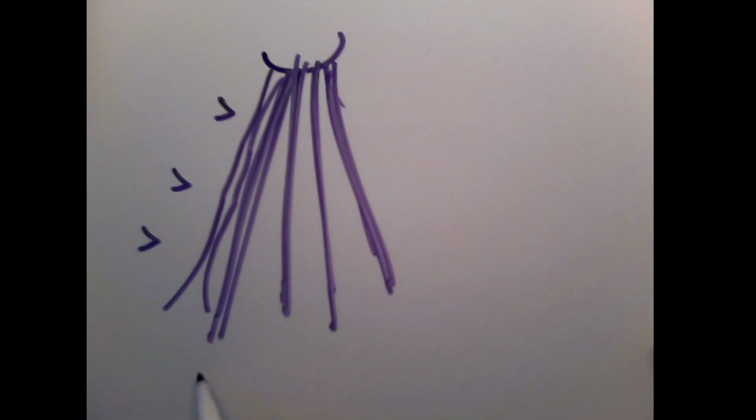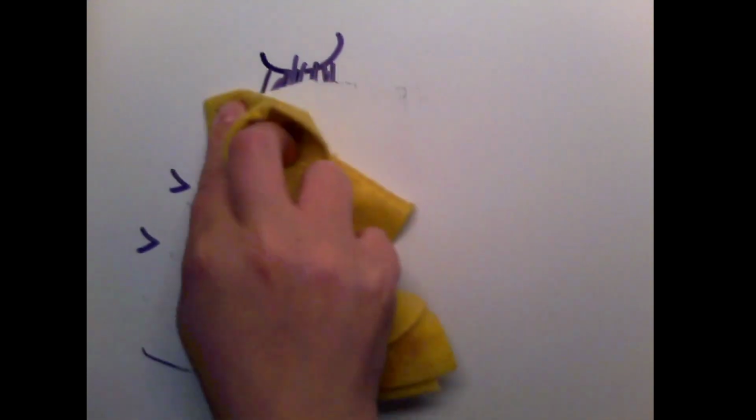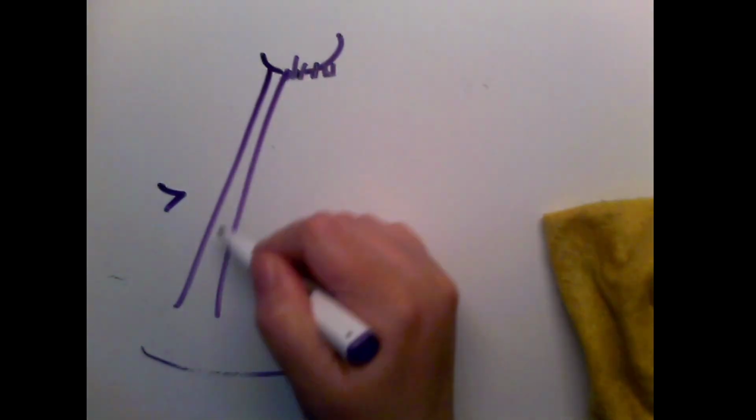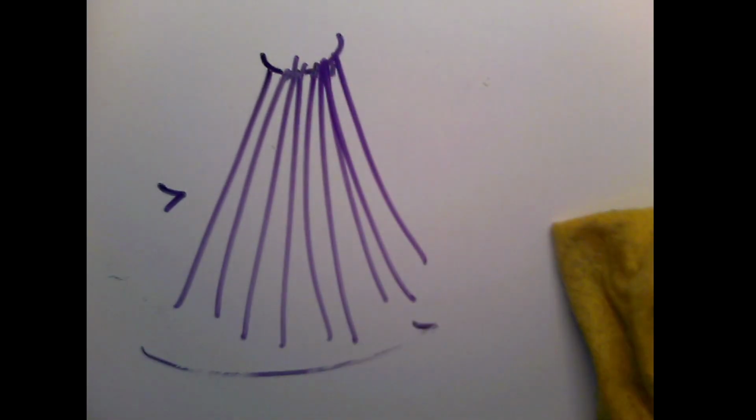Now you can see that that would take a lot of time to make 150, 250 scan lines all the way across our image. We are going to miss moving structures within there. That would be opposed to a single focus, where now it's just steering and firing in new directions. It's going to make that one picture very quickly compared to the 3.